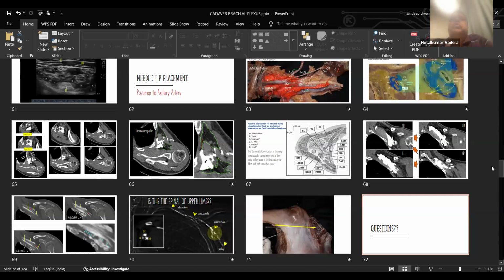It is shown as swelling of any fascicle. Yeah, swelling of the fascicles, but there is a certain value of the size. Beyond that, if it increases, you stop injecting local. And the third is 15 to 20 psi, which would be very high when you look at it using pressure monitoring.